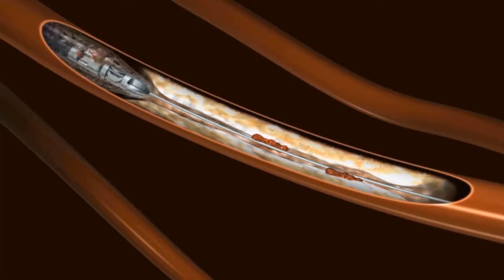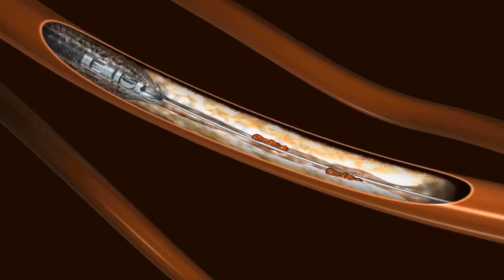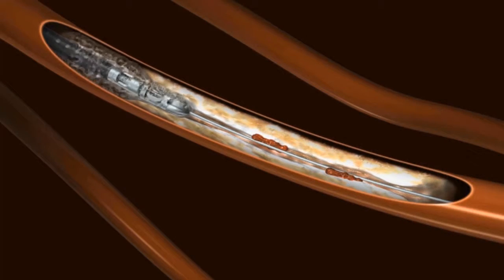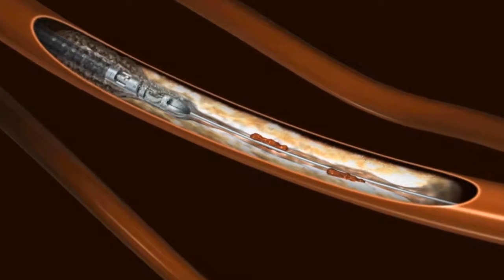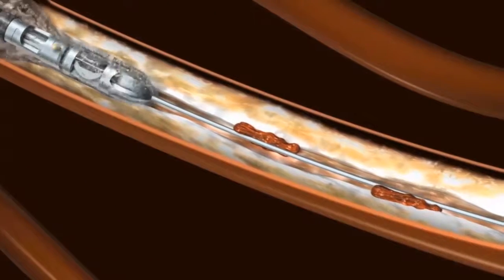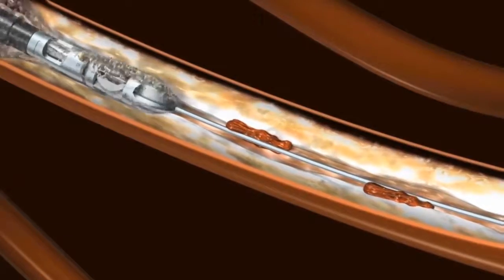We're hoping to showcase today the aspirational atherectomy JetStream device followed by finishing the therapy with drug-eluting balloon angioplasty. We hope you enjoy this demonstration.